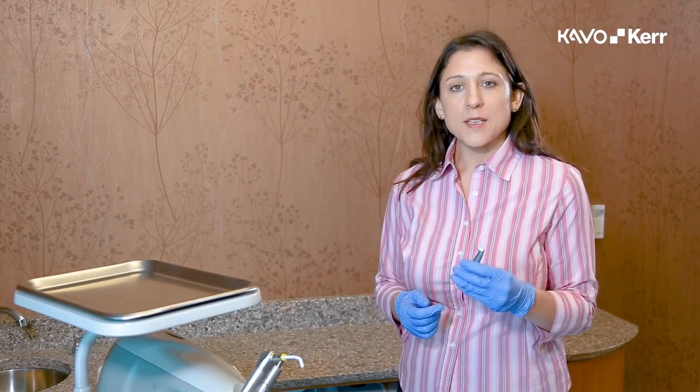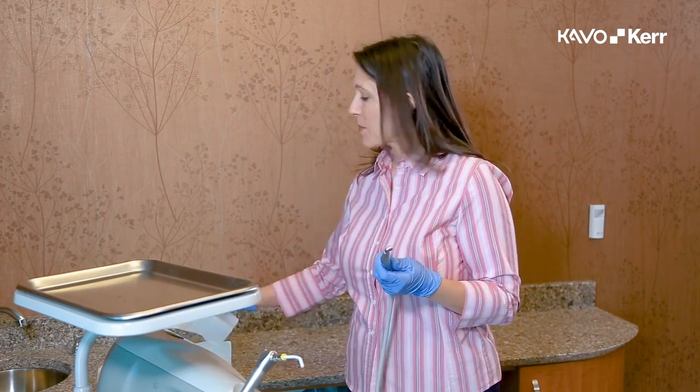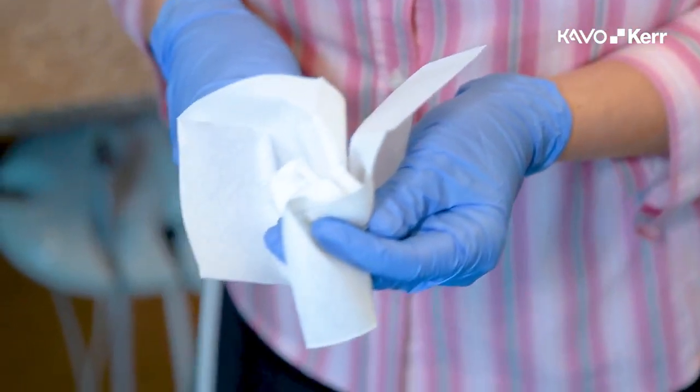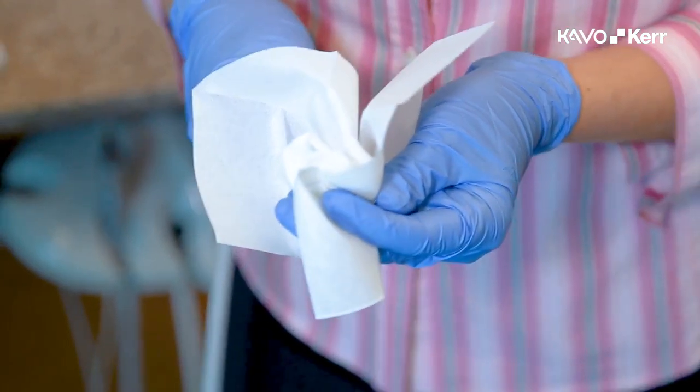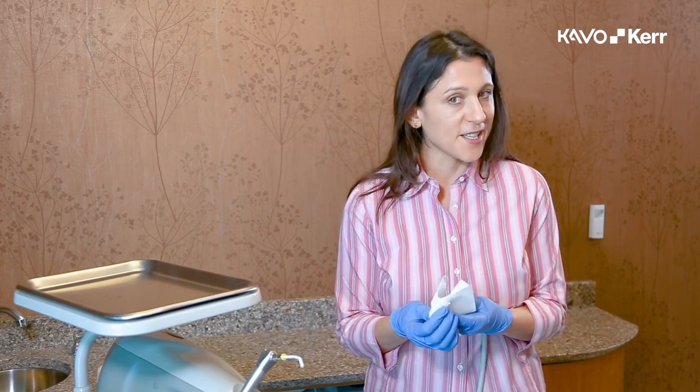Connect the handpiece to the air supply to purge. Before you can apply air pressure, position the head of the handpiece with a paper towel to prevent a mess. Run the handpiece for approximately 30 seconds. If the purged lubricant on the paper towel is not clear, re-lubricate and purge until the fluid is clear.